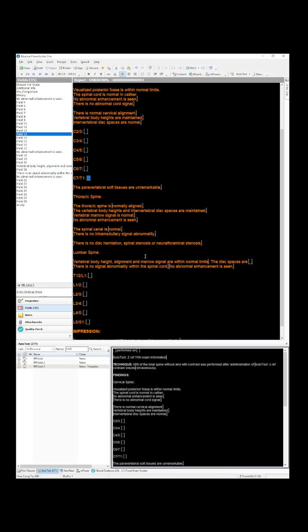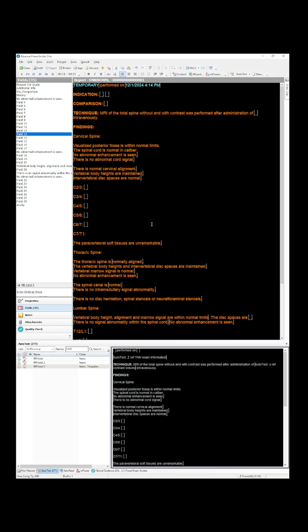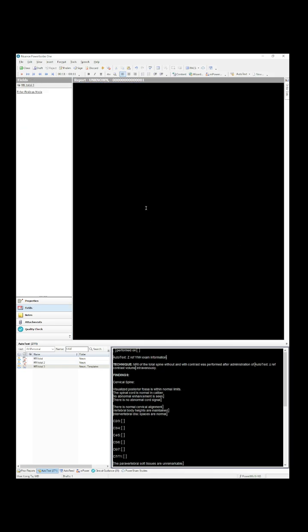If we're talking about a focus of spinal infection, an intraspinal abscess, an epidural collection, prevertebral collection, those sorts of things, I tend to try to use a more clinically, or let's just say an actionable finding sort of approach. And so let me just show you what I use.